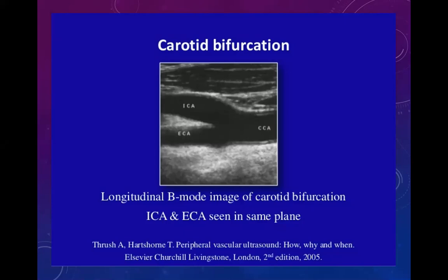Do a thorough mapping and landmarking of the arteries, whatever you are seeing. Don't worry about the time, because this is what gives you key information about the surgery that you are going to do. And sometimes even better than angiogram, I would say, the Doppler is. So do not undervalue a Doppler anytime.